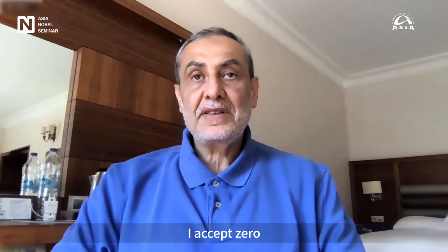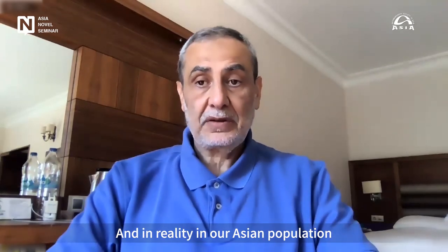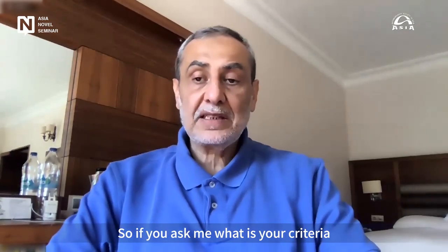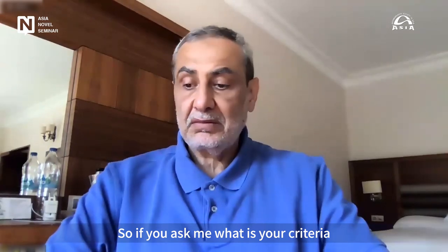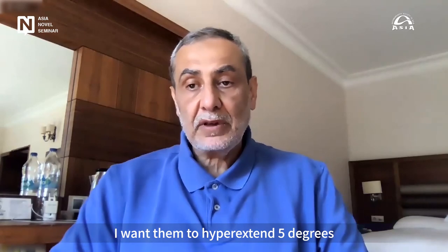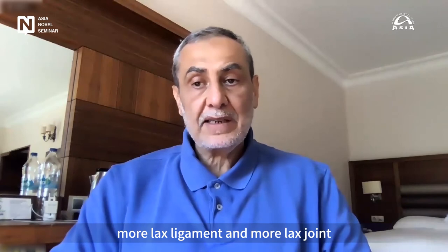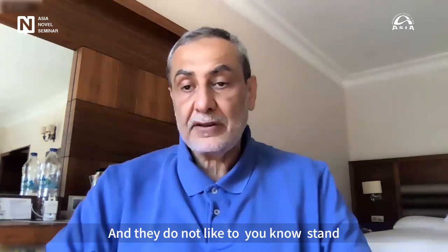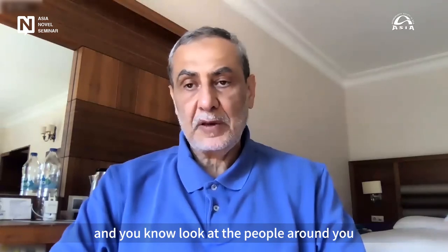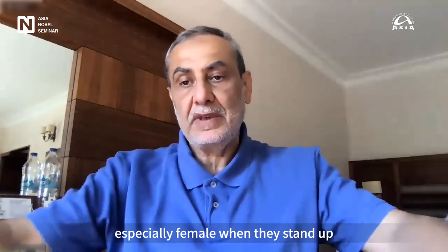I accept zero. And in reality, in our Asian population, they tend to hyperextend. So if you ask me, what is your criteria? I don't even accept zero. I want it -5. I want them to hyperextend 5 degrees because the Asian population has more lax ligaments and more lax joints. Look at the people around you. You see them all hyperextending, especially females, when they stand up.